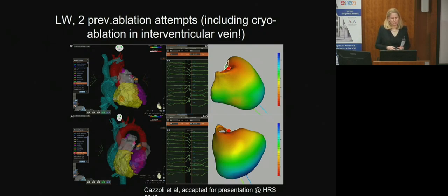And we did, of course, the Vivo mapping. And I show you here on the right-hand side, that was the only monomorphic origin that she had. And you see that this fits very nicely to this, the pulmonary artery here to the right, at the middle in between, right there. So this would be the aorta. You don't see the aorta itself, it's not reconstructed. And the pulmonary artery would be there, and that's the red dot marks the earliest spot on Vivo.